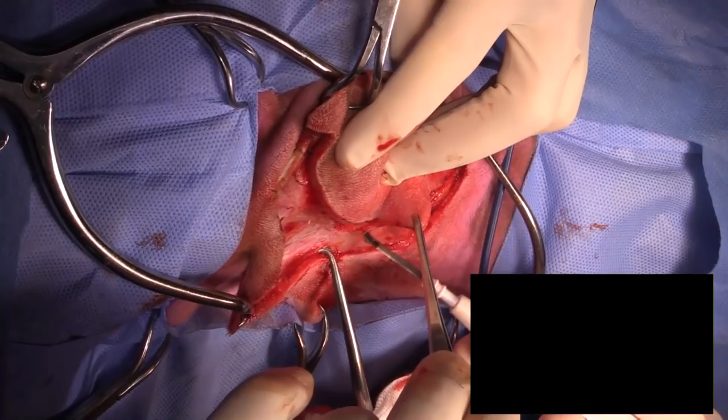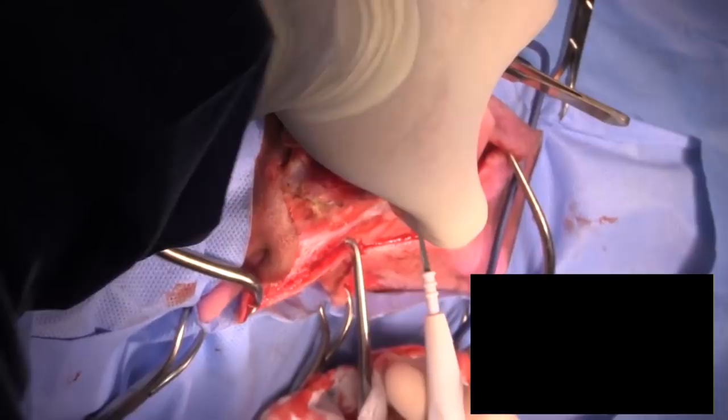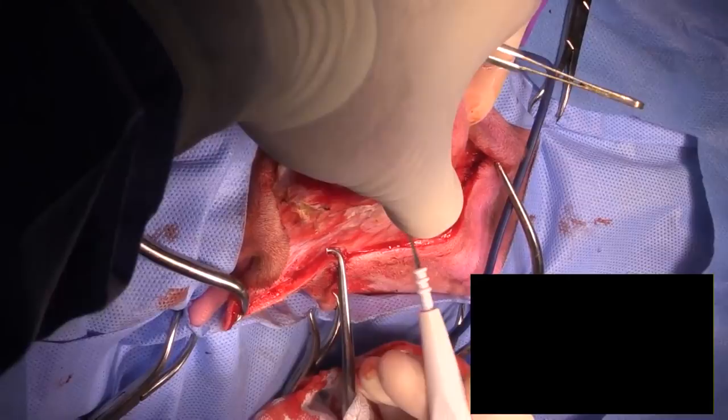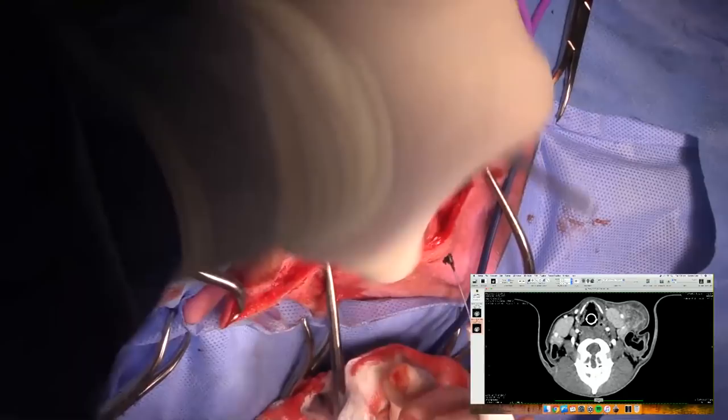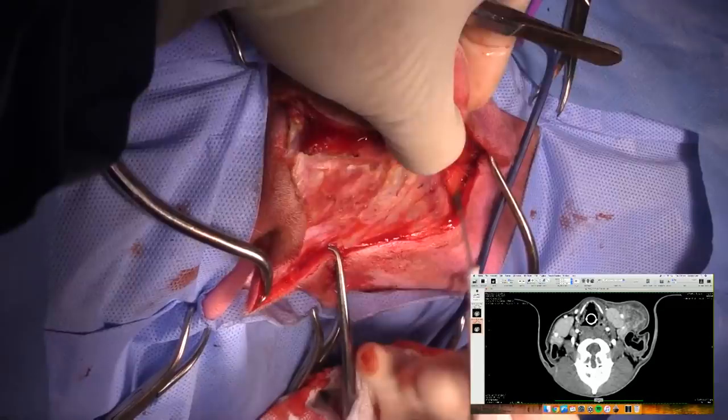So I'm down to the jugular vein sitting right here. And if I puncture that jugular vein, that really wouldn't concern me very much. I would just ligate it. I'd rather ligate it before I puncture it. But if I inadvertently puncture it, I'm not going to panic. Jess, can you just take that off screen saver? So I'm down to the platysma muscle here, and I am going to have to sacrifice that jugular vein. It's going right through the center of this thing. Again, that doesn't bother me at all. Hopefully it won't bother the dog.